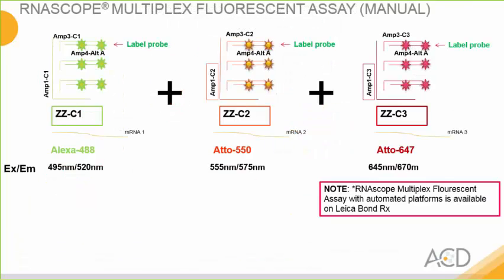Okay. So what about triplexing with the multiplex fluorescent assay? Now, 3 separate amplification trees are being built at the same time.